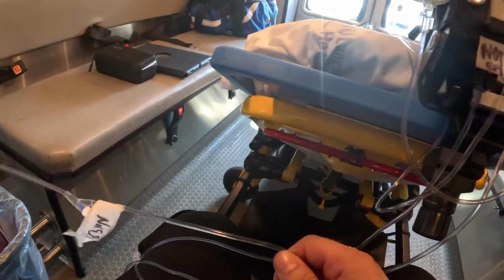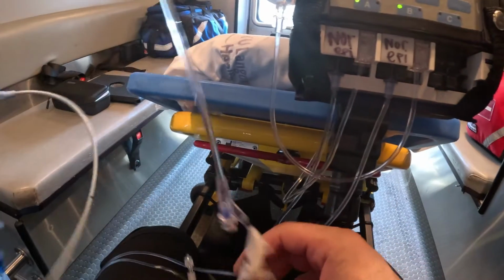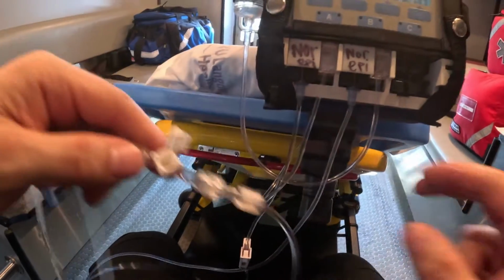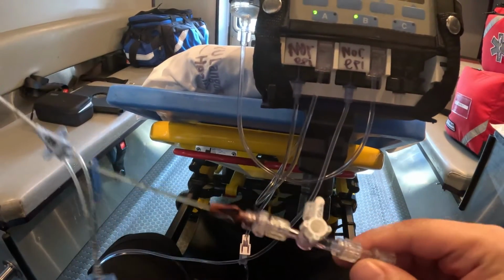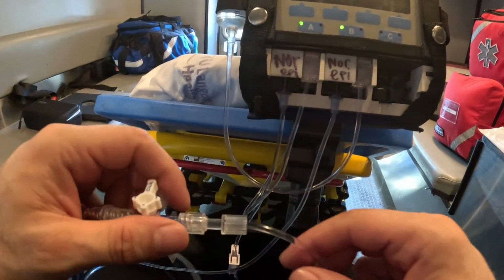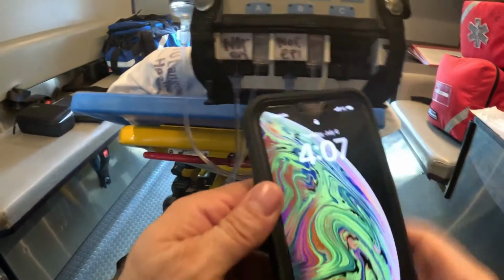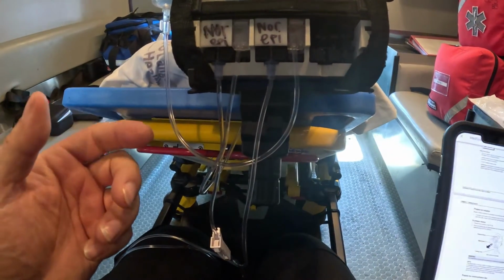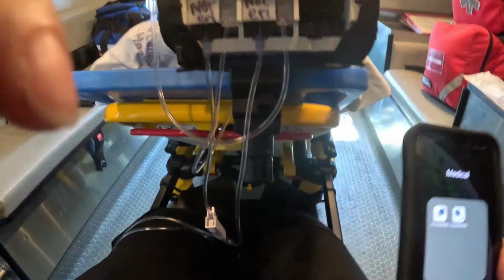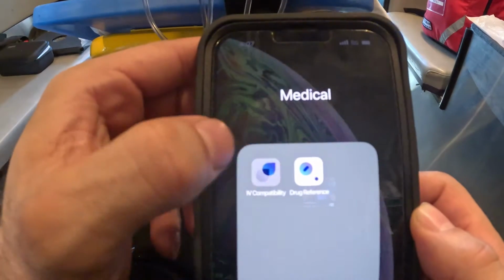Usually I have a central line right here. So this is a central line, and you notice I am running my pressor. We said this is norepi. I'm running it via central line, so this is how it's infusing. What you can do is use an app called Micromedex. Let's say we have dopamine and norepi, two drugs. This is the app right here, IV compatibility at Micromedex.